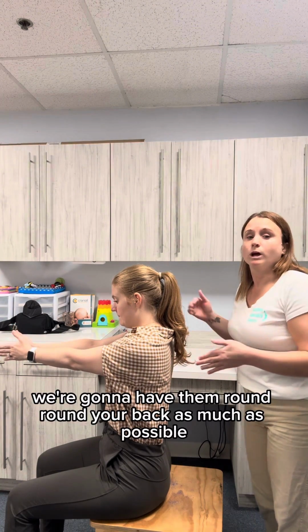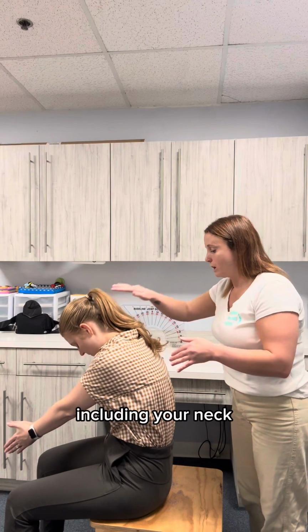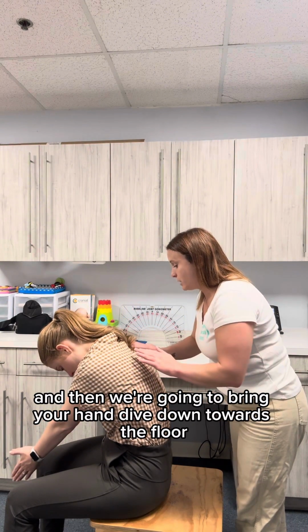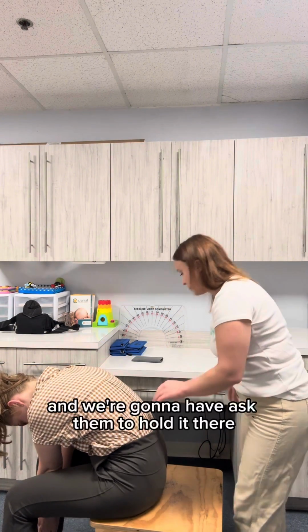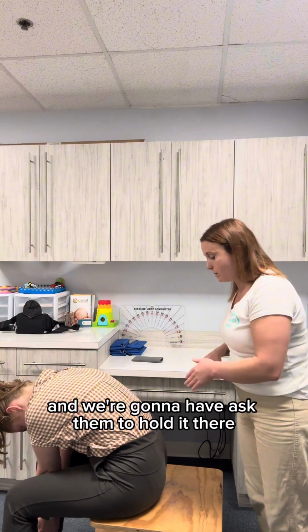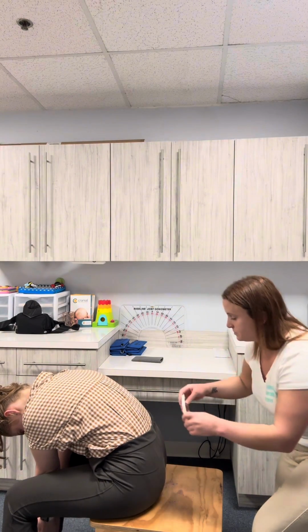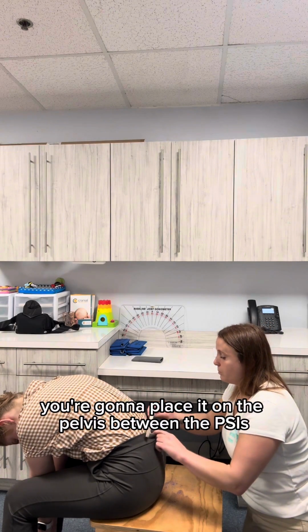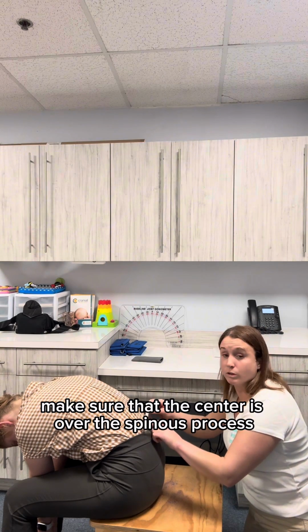We're going to have them round your back as much as possible, including your neck, and then dive down towards the floor, keeping your hands between your knees. And we're going to ask them to hold it there. And then we're going to take our scoliometer and we're going to start at the pelvis. I'm going to place it on the pelvis between the PSIS. Make sure that the center is over the spinous process.